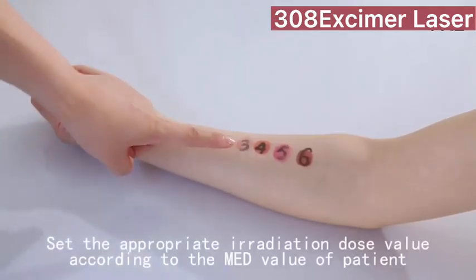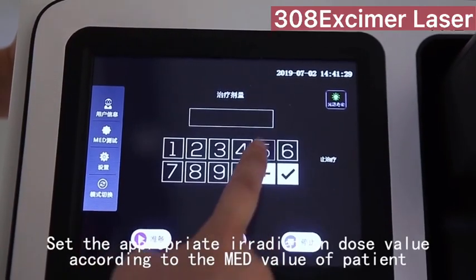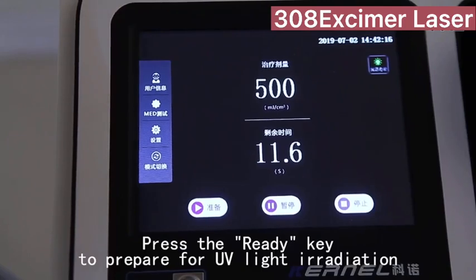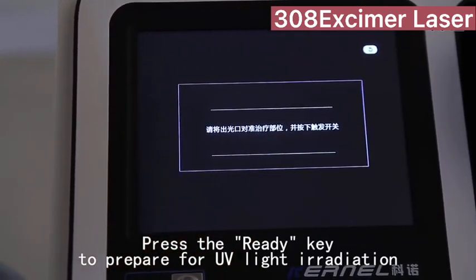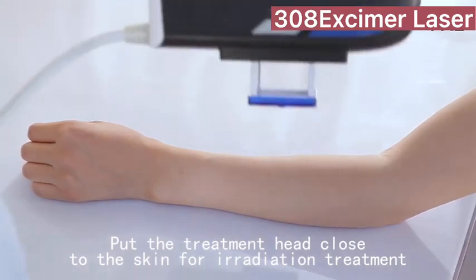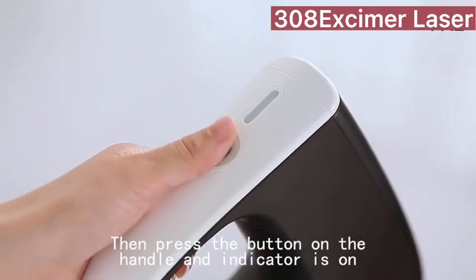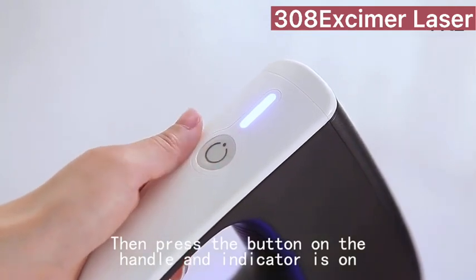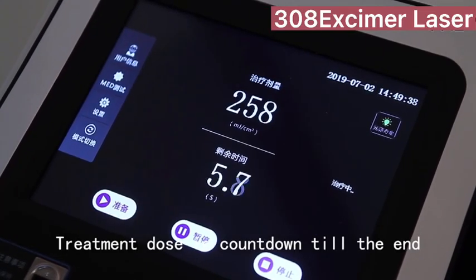Set the appropriate irradiation dose value according to the patient's value. Press the ready key to prepare for UV light irradiation. Put the treatment head close to the skin for irradiation treatment, then press the button on the handle. The indicator light comes on and the treatment dose counts down until the end.